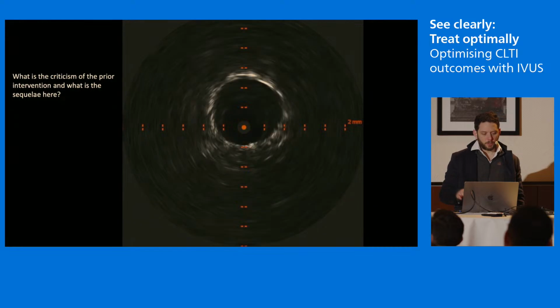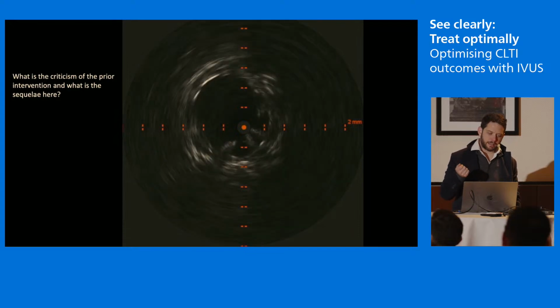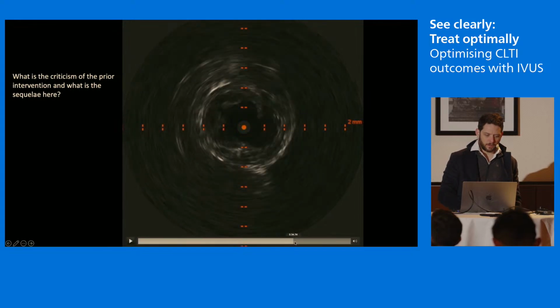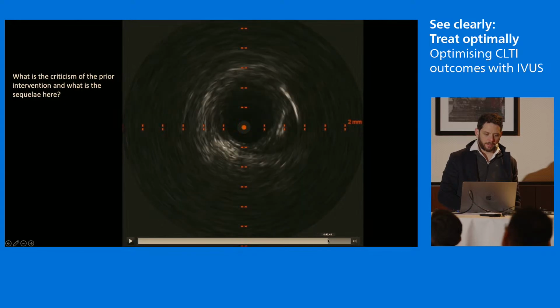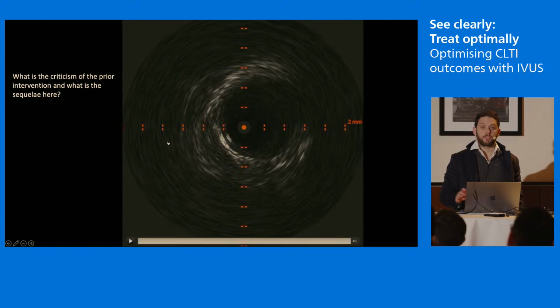As we come towards the bottom of that stent graft, the bottom of our run ends in the bifurcation of the common iliac artery. That's the bifurcation of the common iliac artery, and then we're into the external iliac artery there. So it's a really simple question, but what is the problem with their strategy of how they treated that?